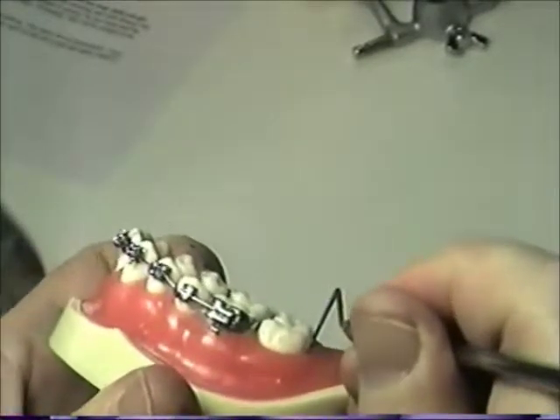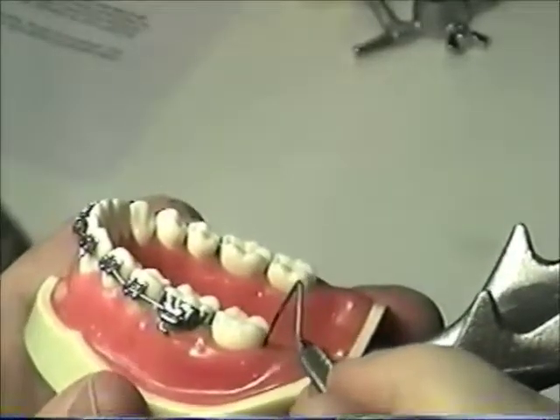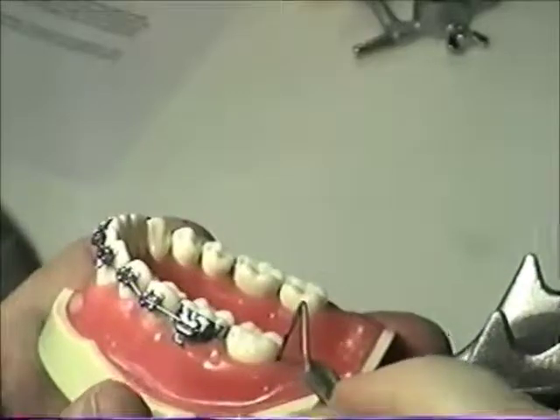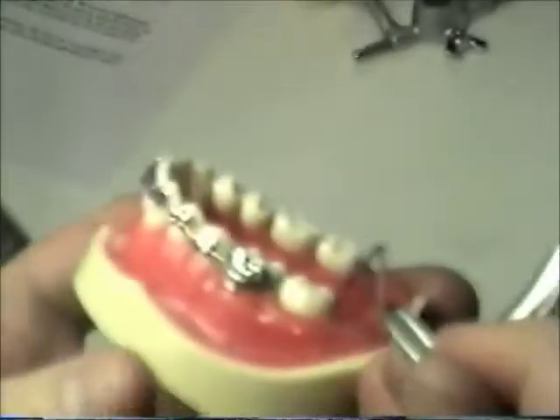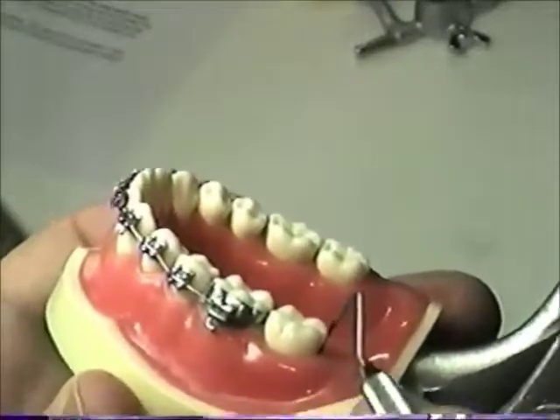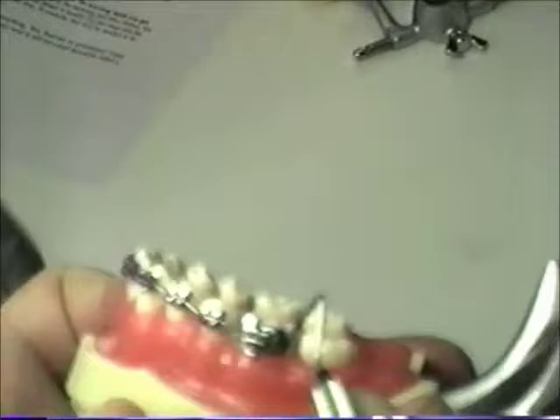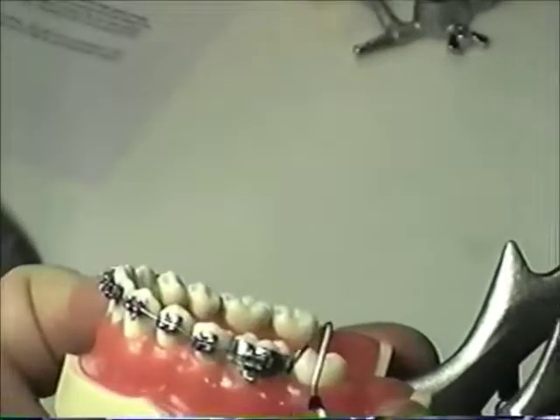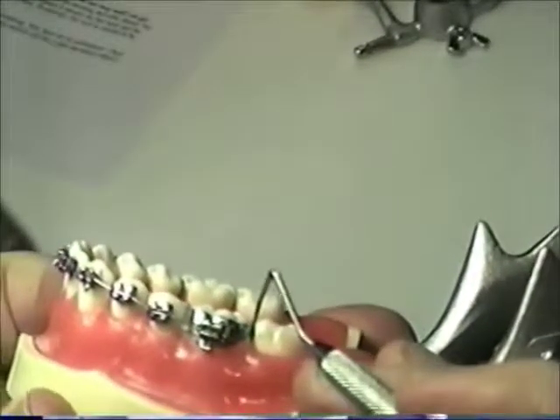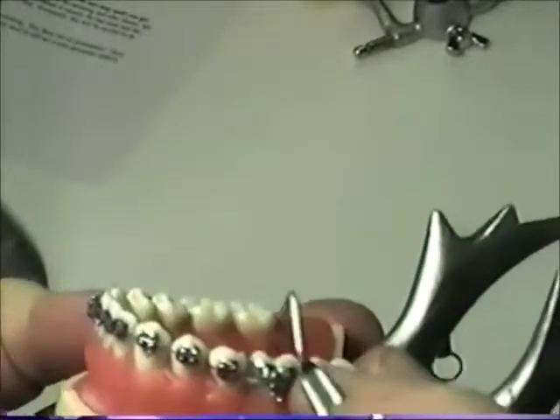But watch right there. Oh my God, there's actually a gum disease right here. If it sinks into that black or more, you've got a problem. Because basically what that is, bacteria down in there, you can't reach them, and they're down there eating away your bone and your gum around your teeth. So everywhere this probe goes, between the tooth and the gums, you've got to shoot water in there like a Waterpik. Now how can you do that and feel that is you can actually feel it going up under your gums, and you've got to make sure that you're aiming that under there and here.